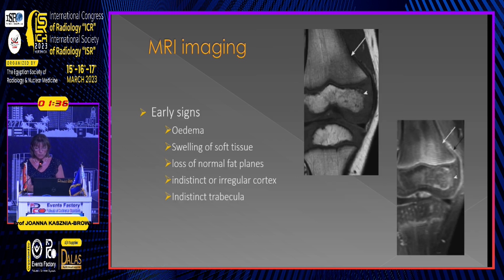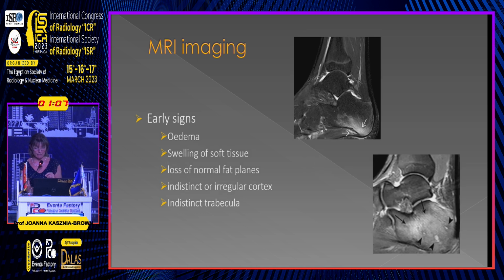And again, we can look at if edema is extending or the changes extending into the periosteum. I can see here the small amount of fluid adjacent and the changes within not only metaphysis, but the changes extending here into the epiphysis and the secondary ossification center. So again, very, very important, because if we don't react very quickly, the ossification center will be damaged and the child growth will be definitely affected.